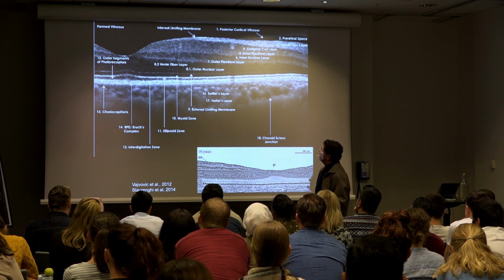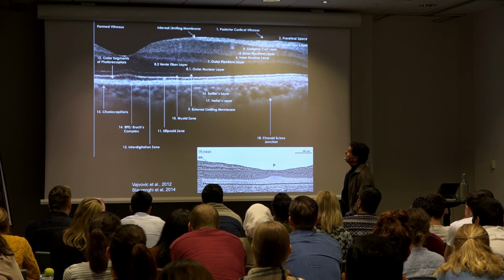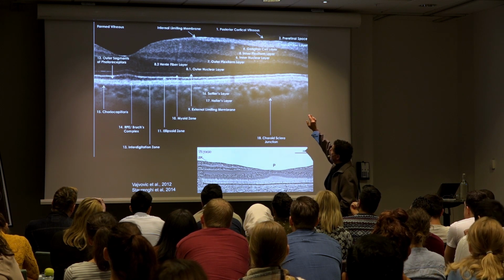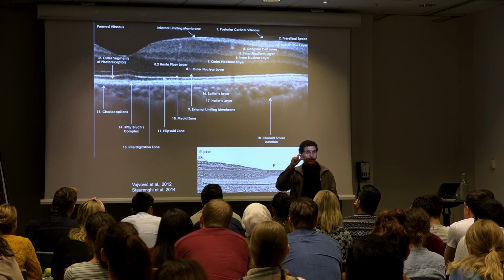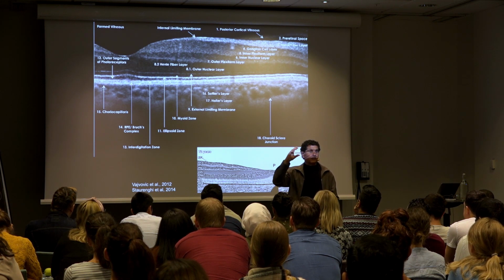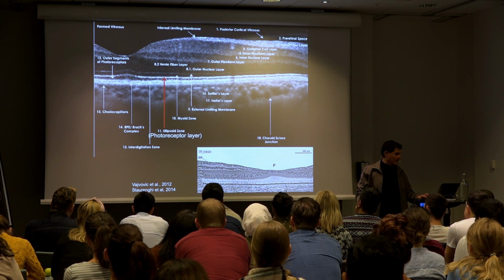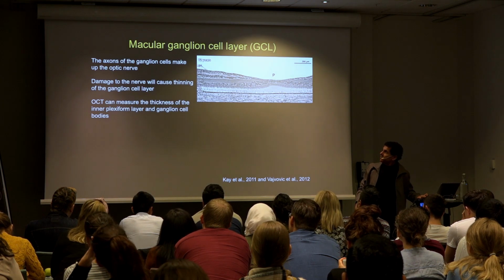And then remember, in the inner retina, we've got the nerve fiber layer, which is highly reflective. Most manufacturers lump the ganglion cell layer and the inner plexiform layer together as the ganglion cell complex, because the features are not great enough to specifically differentiate the two. Both of them are usually affected when the ganglion cell is lost because their dendrites are affected. So most algorithms will combine those together, which is just fine. Those are the main layers that we really concern ourselves with.